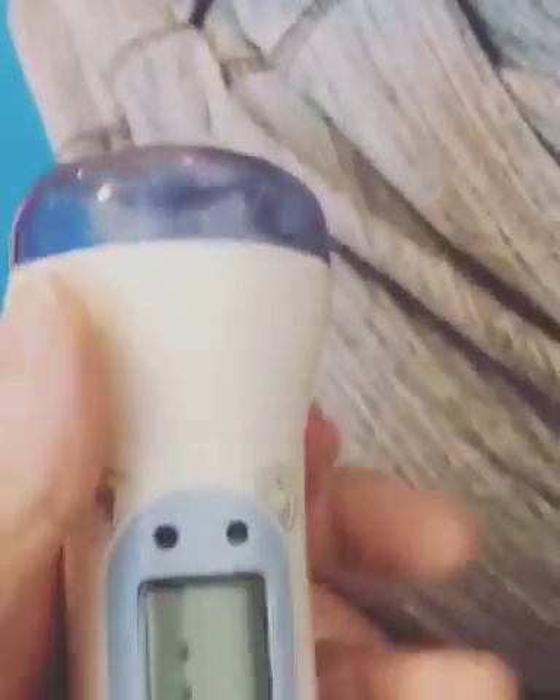All right, I got this little thermometer to try. It has a really good lid that keeps it clean.